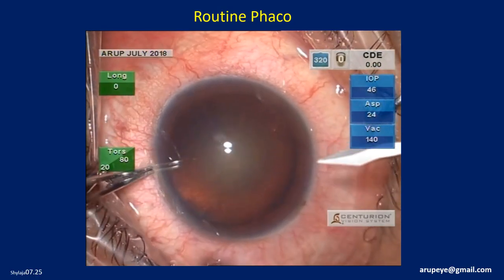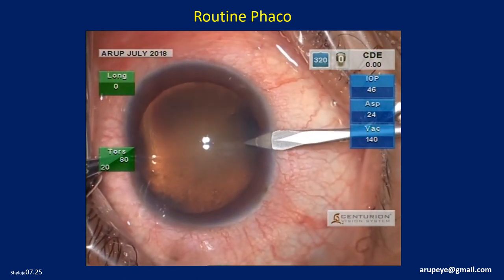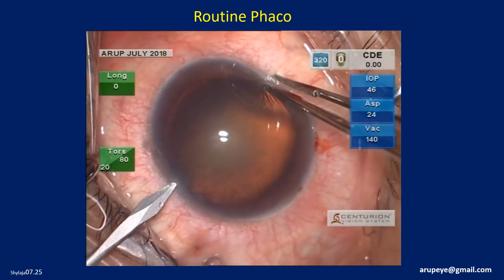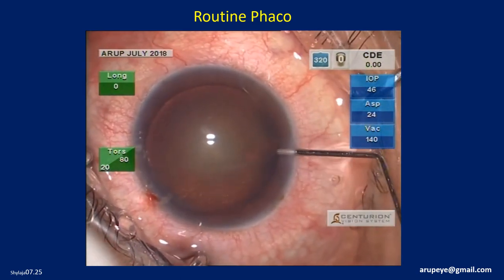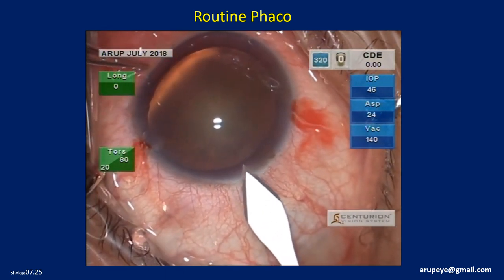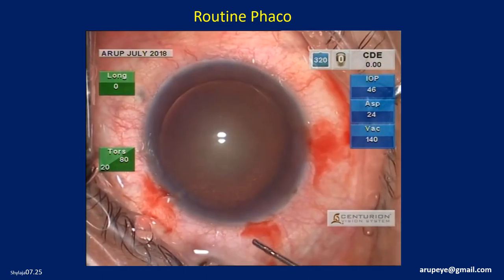Two side ports are created using sharp MVR knives, one inferiorly and the second one superiorly. The anterior chamber is deepened and pressurized by injecting BSS. A temporal clear corneal incision is created.